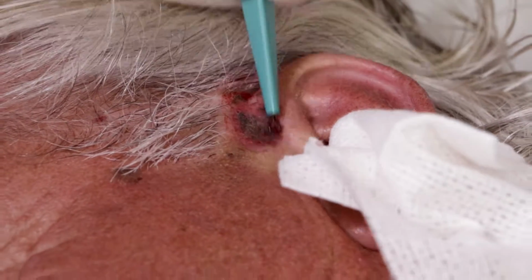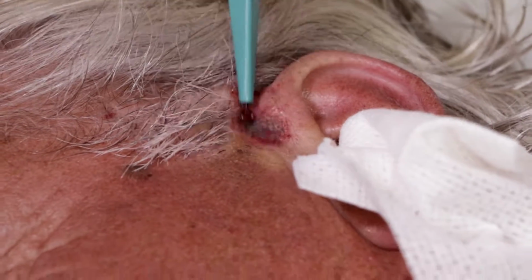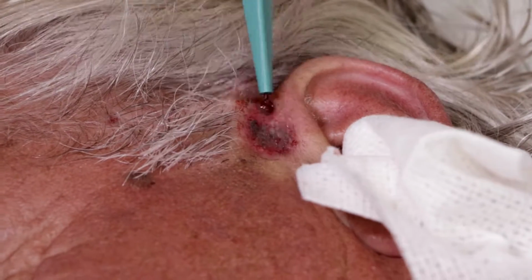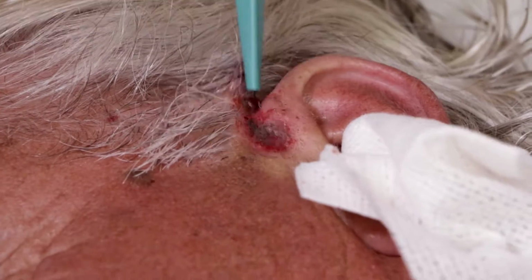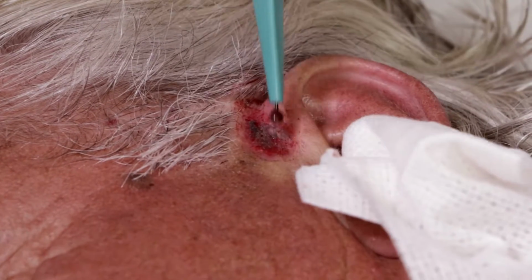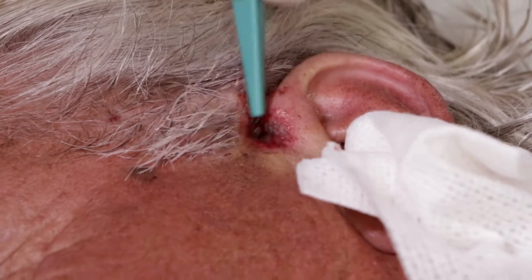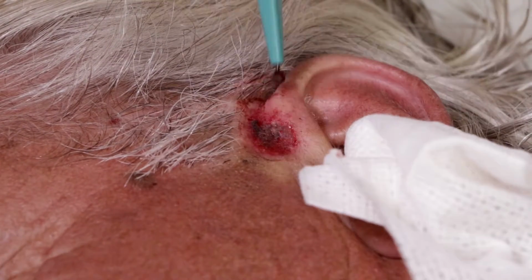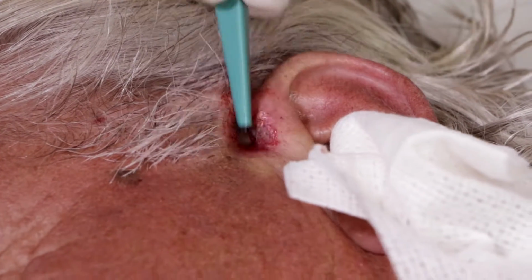My assumption is that somewhere in the studies, somebody found that it's more effective to do it 3 times than to do it 1 time. But I actually haven't gone through that part of the literature myself. I've just gone through the textbooks that say this is the standard way of doing it. And what's interesting is the curette is not taking off some of the area where we did the cauterization.